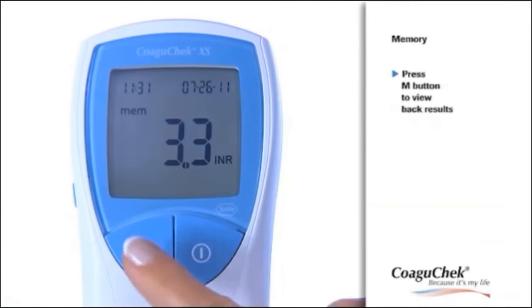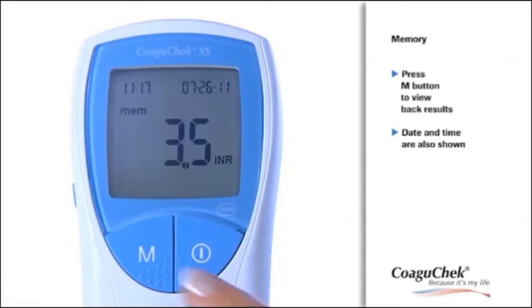To view back results, press the M button. Date and time are also shown, so that it is easy for you to enter the test results in your coagulation diary and for your doctor to interpret the values, so you can be confident that your therapy can be optimally geared towards your needs.